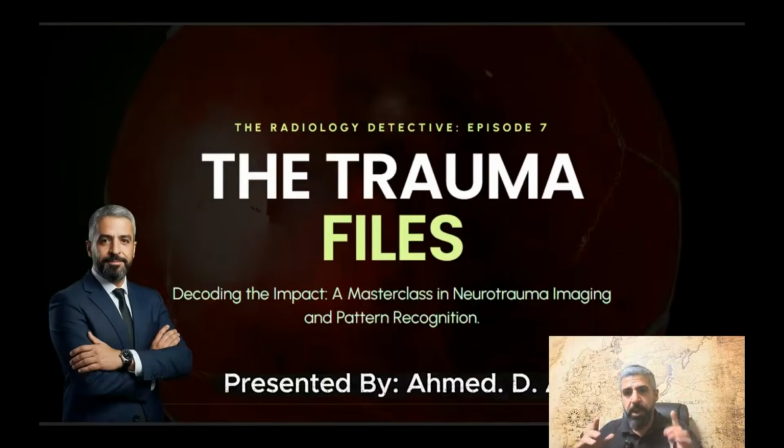Welcome back, detectives. Today, the clock is our biggest enemy. We are opening episode 7, called the trauma files. When the head meets impact, the brain doesn't just bruise. It shifts, it bleeds, and it fights for space. We are hunting for the red flags of impact. So let's start the clock.